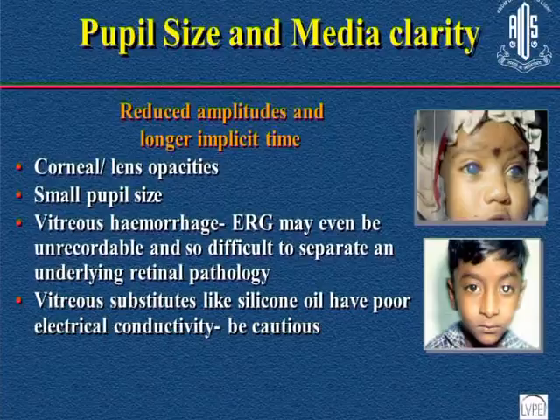It is not a good test. Silicone oil will show absent responses even when the retina is normal, because it cannot conduct those electrical responses from the retina to the cornea. So be cautious.